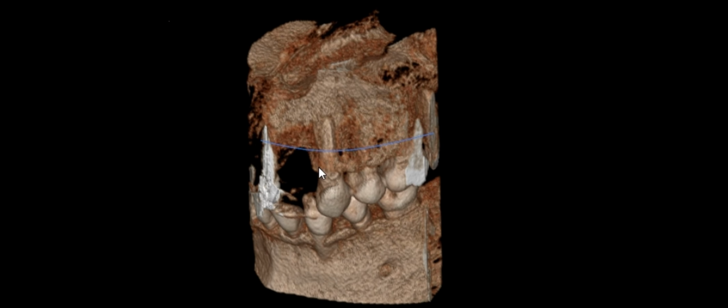Okay, so here about 9 months after the grafting was done, on the 3D image, you can see a very good bone contour, very good bone bulk in this area for us to place a very reasonably sized implant. And if you come up further up here onto this image, you can see where the native bone was originally in place, and you see the grafted bone. So significant bulk in the graft material in this section.